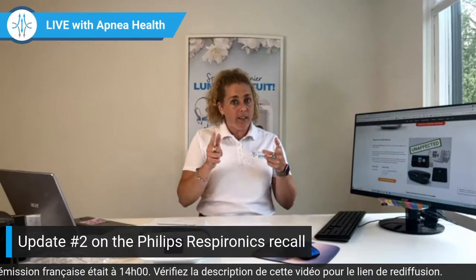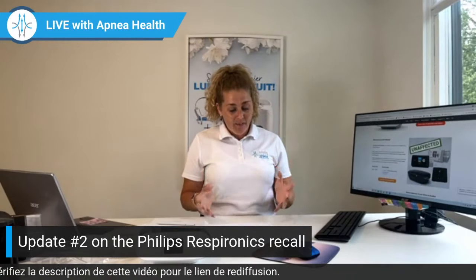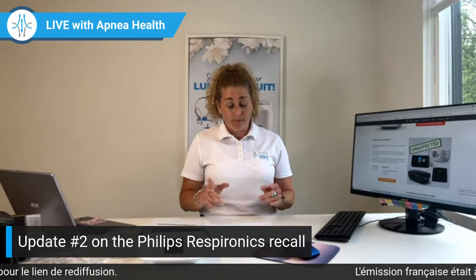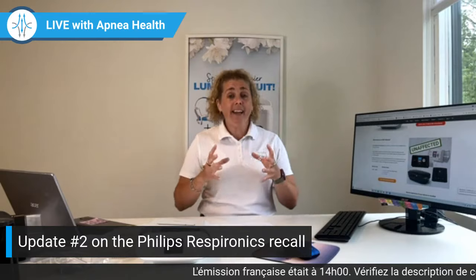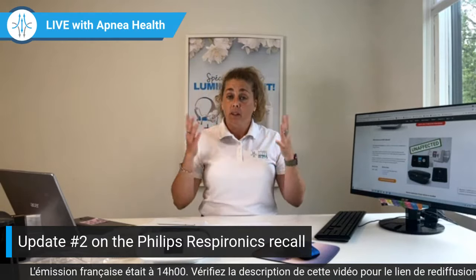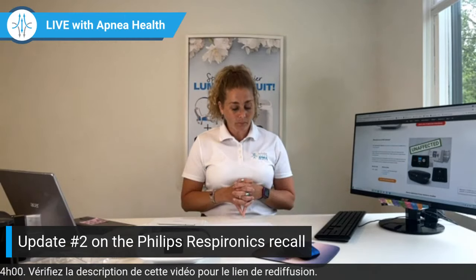Yes, that's the guy who's selling those ozone products. So if you have used ozone, I suggest you please stop using it. Second, also, in high heat conditions, the foam might degrade. Here in Canada, not sure that's something that would happen.